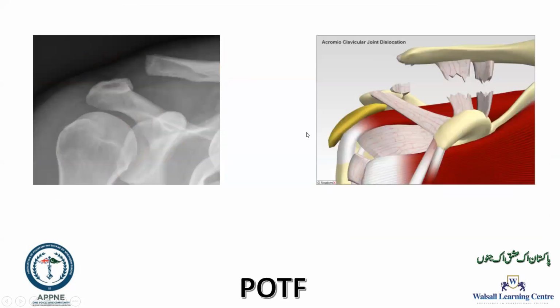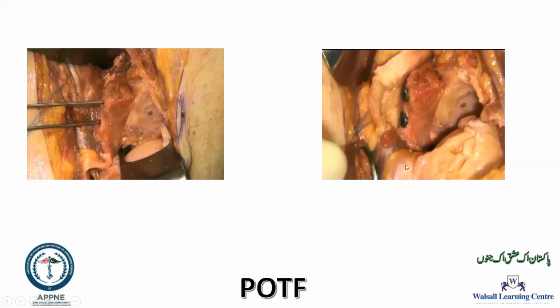When you do this, you can see this is the conjoined tendon. Can you see that? Yeah. This is the coracobrachialis and the biceps tendon attached to the coracoid. And this is the subscap margin. So when you go in abduction and external rotation, this acts as a hammock, and it stops the head from dislocating.